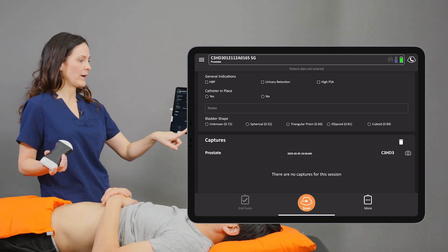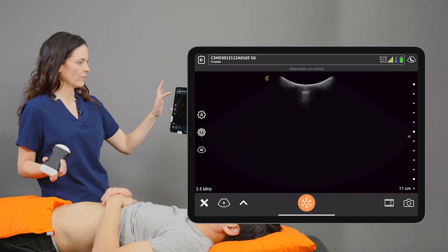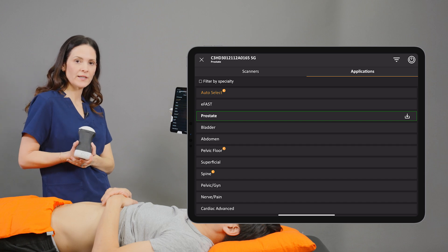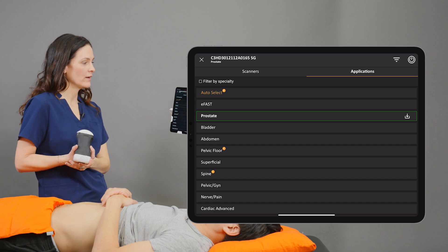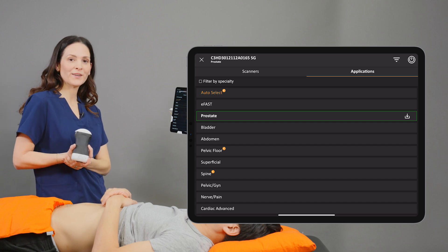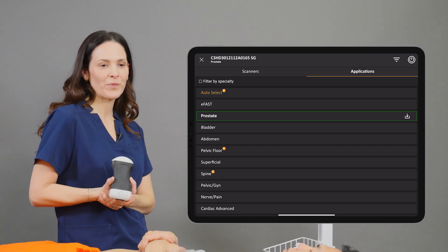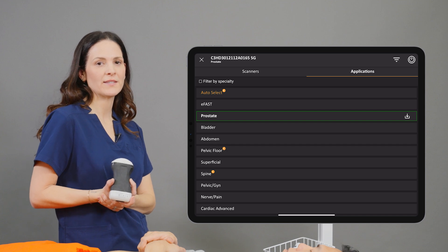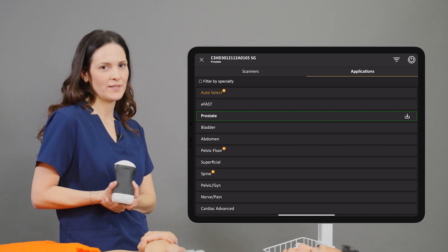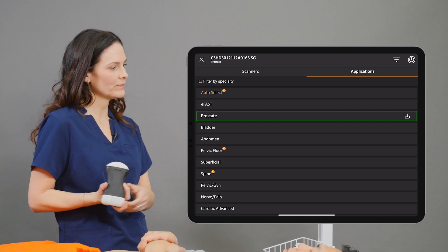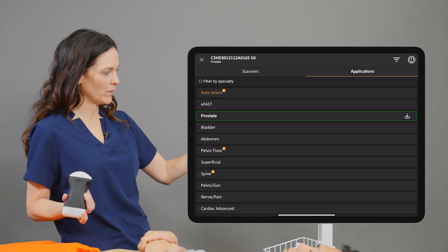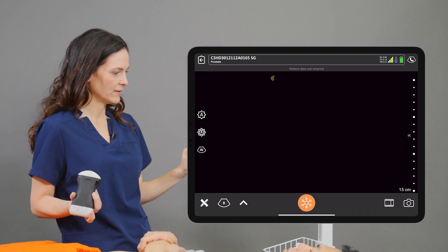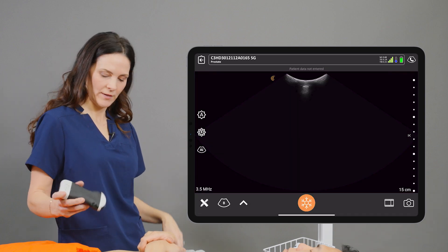I'll tap the scan button and I've selected the C3 scanner for today's scan, but just take note that the Prostate AI is also available with the EC7 endocavity scanner. Under the applications tab I'm going to select the Prostate preset and we'll begin our scan.